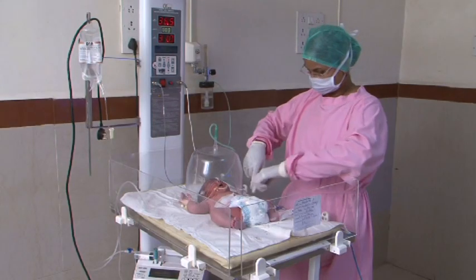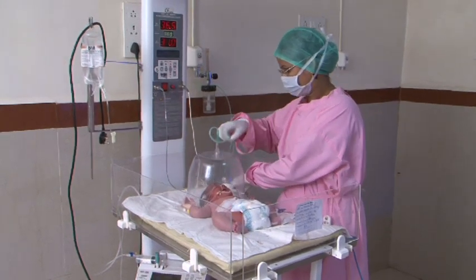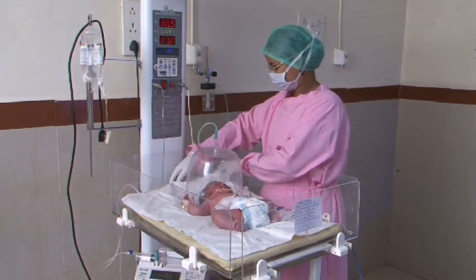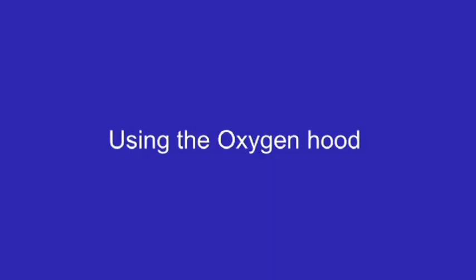Oxygen hood. An oxygen hood headbox is a good device to achieve oxygenation in the newborn, in severely distressed infants, and in emergency situations. Using the oxygen hood.